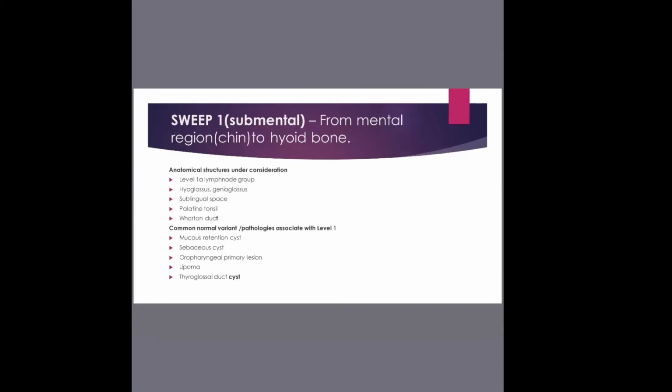So if you're saying the thyroid measures 36 by so much, it doesn't help the clinician. They want to know, is it enlarged or not? And if it's enlarged, what can you see sonographically that is causing it to be enlarged? If you're not seeing nodules, then your duty is to say, okay, the thyroid gland appears enlarged. In that case, if you want to put a measurement, fine. If you don't want to put a measurement, it's up to you.